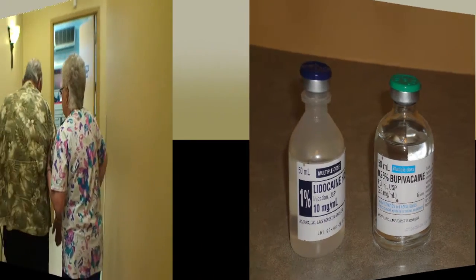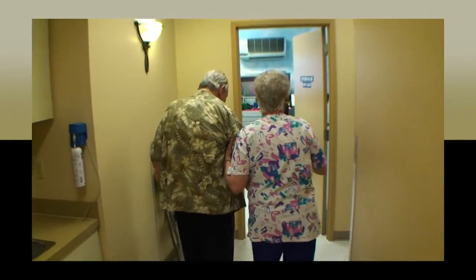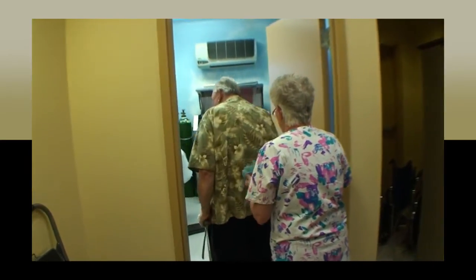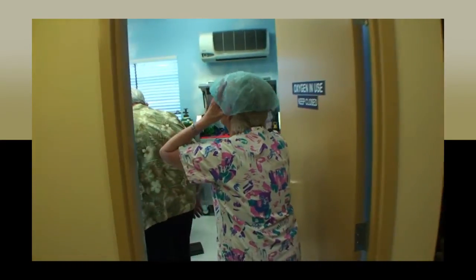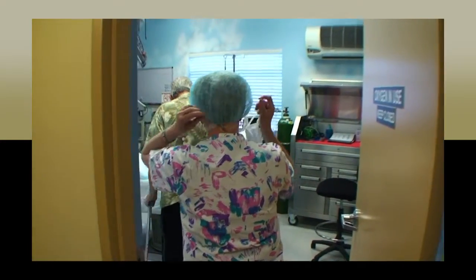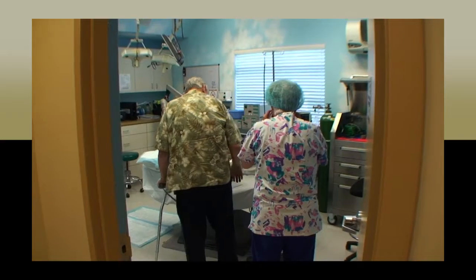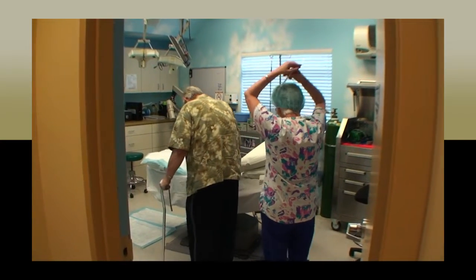After the room has been prepped, each patient will then be escorted to the room and you will take the IV bag, being careful not to pull the IV from the patient's vein. When placing patients on the table, you will need to make sure you have assessed the needs of the patient, surgeon, and procedure so you can use any positioning aids if necessary.